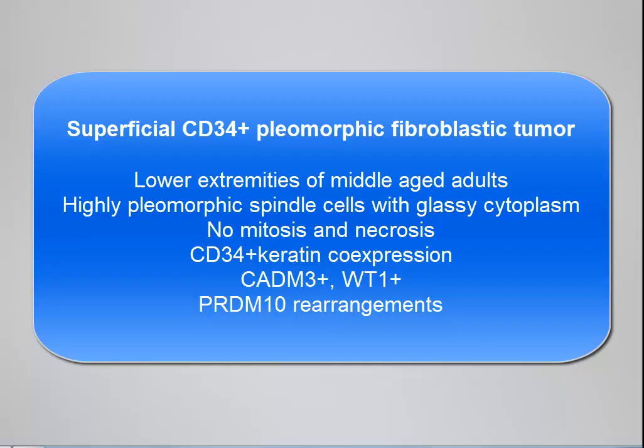Usually focal expression is seen, and WT1 and CADM3 are expressed in the majority of the cases, and the molecular characteristic is PRDM10 rearrangements.